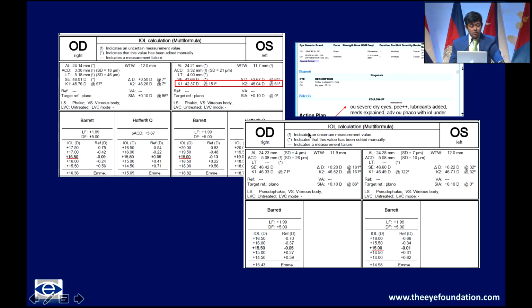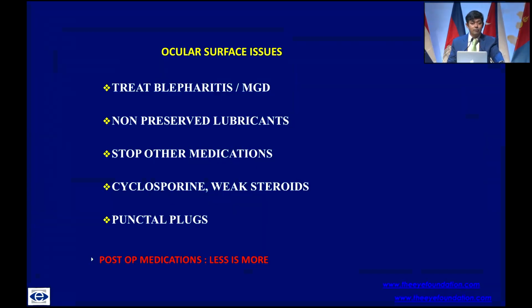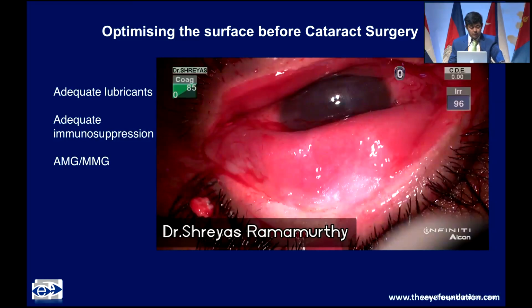You can see that almost 3 diopters of astigmatism, which was there in the first measurement, is now completely gone once the cornea had cleared up. So it was essentially an erroneous measurement, and if you went ahead with the toric IOL, you would definitely have suboptimal results. So it is essential to treat the dry eye, and to do the biometry as the first investigation on the review visit, when the cornea is clearer, is extremely important. Going on to a more extreme situation.